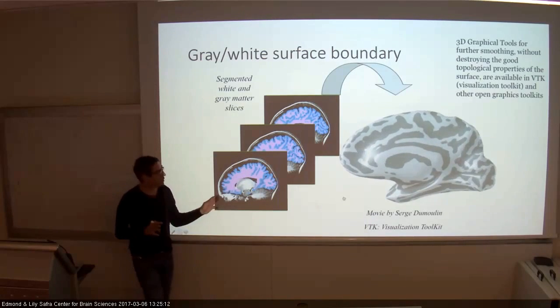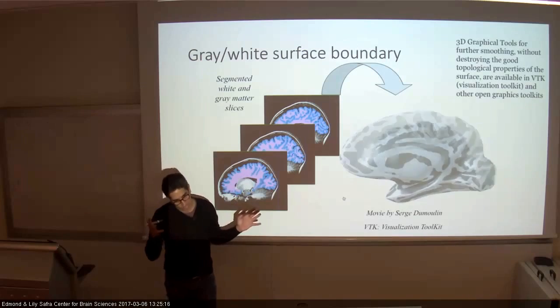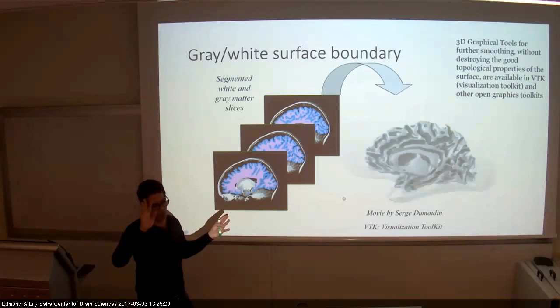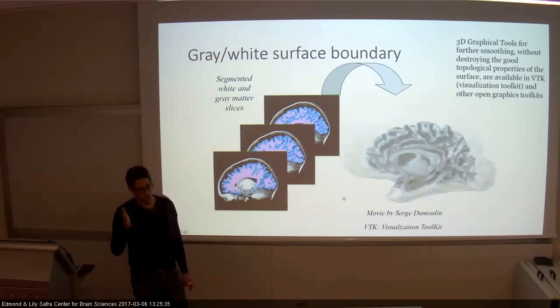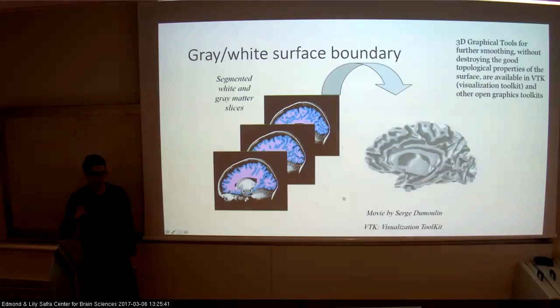No, so first those images typically are done in 3D. So we do 3D measurements. And even if you do it in 2D, you just stack. You take slice after slice, and so you assume they're continuous. For this kind of analysis, you just assume 3D, because you have that slice and another slice. You need to make sure that there is no change in intensity between slices. There are issues with that, but yes, in here we assume it. Maybe you can stack these slices, so it's a 3D thing.